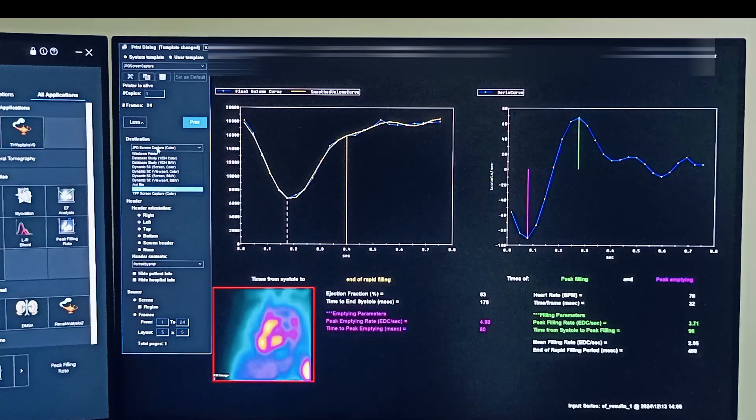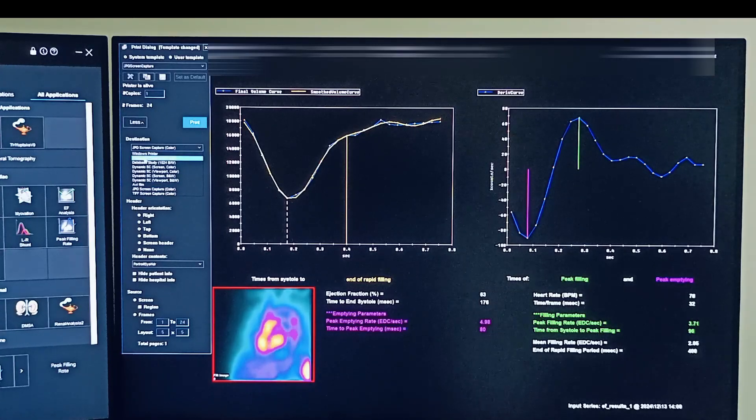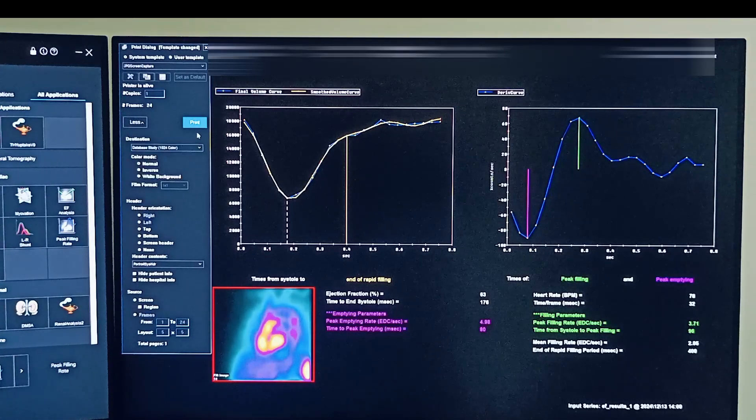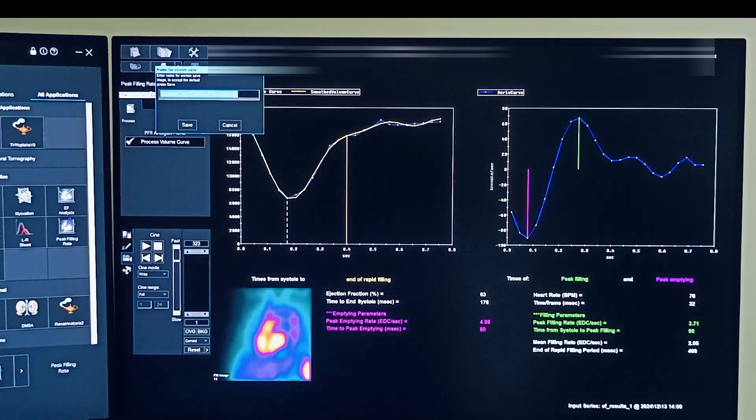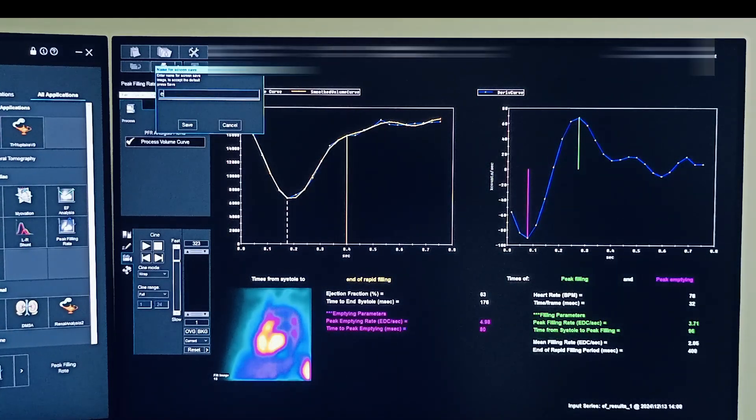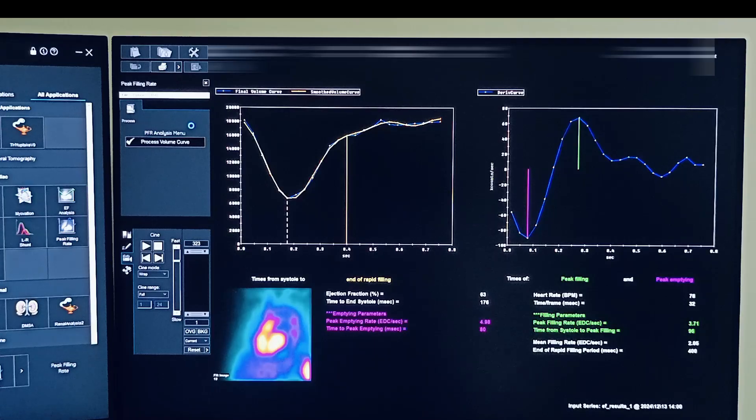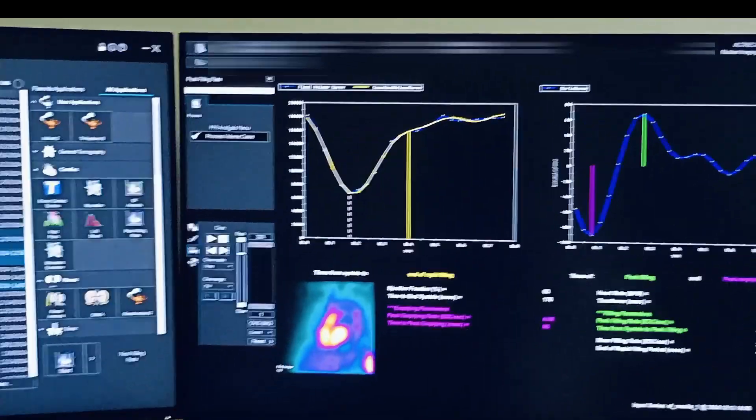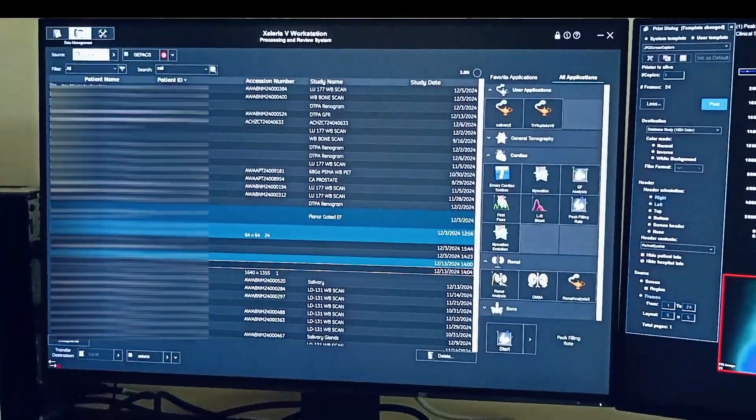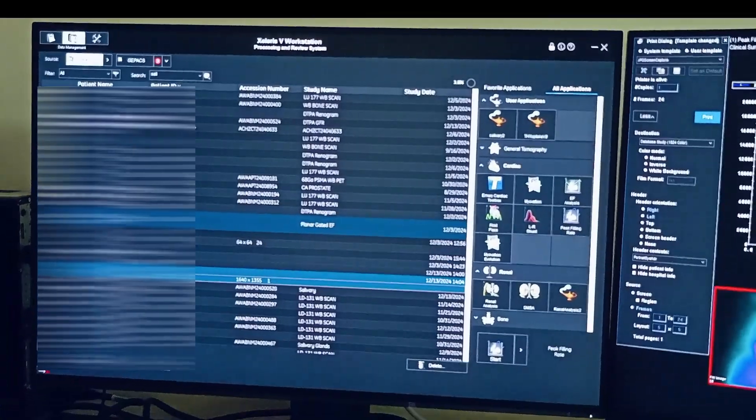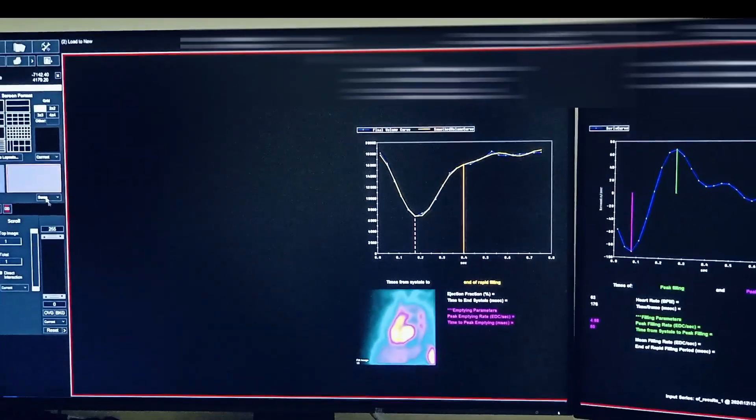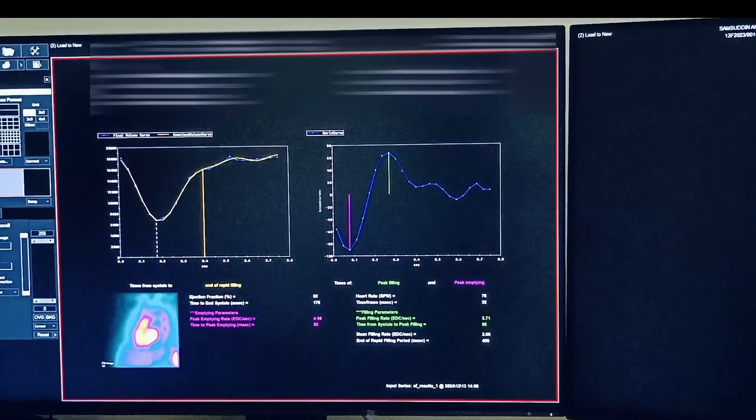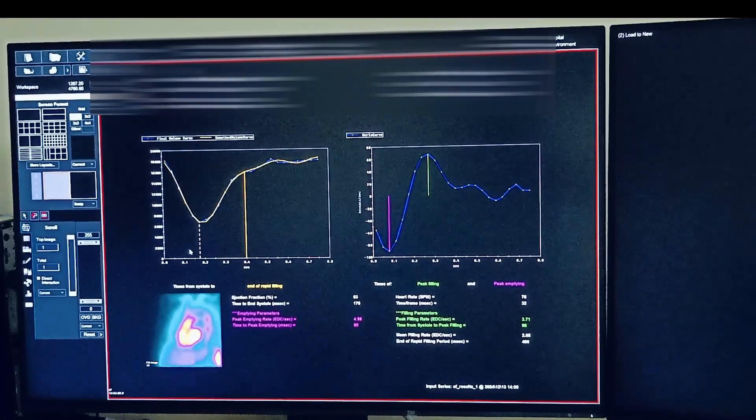So for example, select the database and save it. If you want you can rename it and click save. Then we get a screen cap, and if you double click you can see the screen captures here.